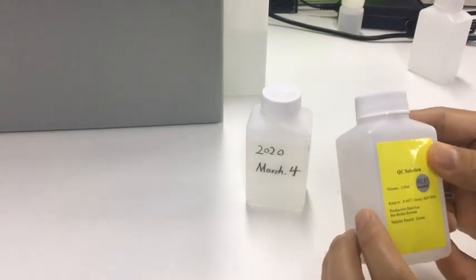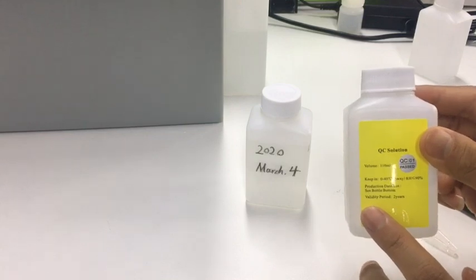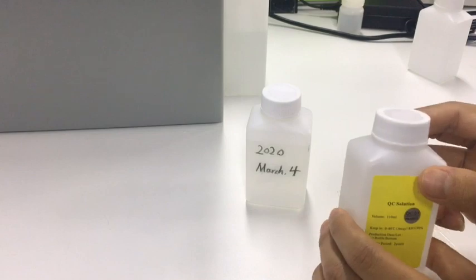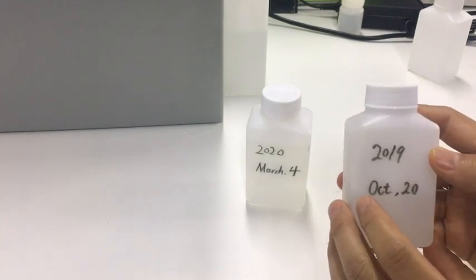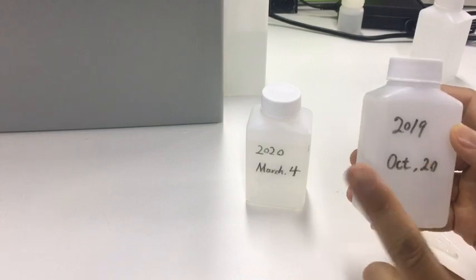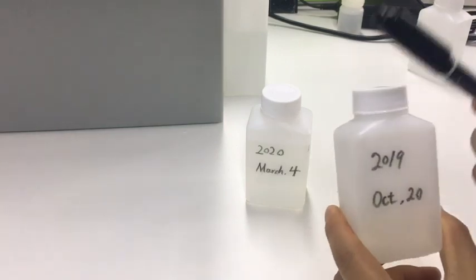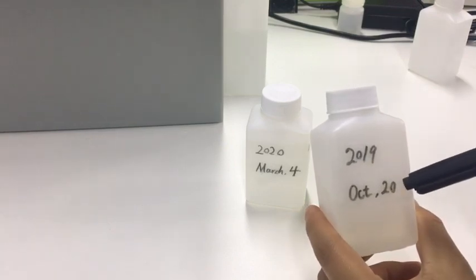The warranty period is two years before opening. But when the bottle is opened, the validity or warranty is one month. So use a pen to mark the date on the bottle so it will be obvious.